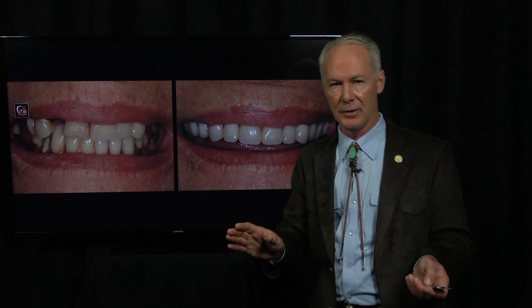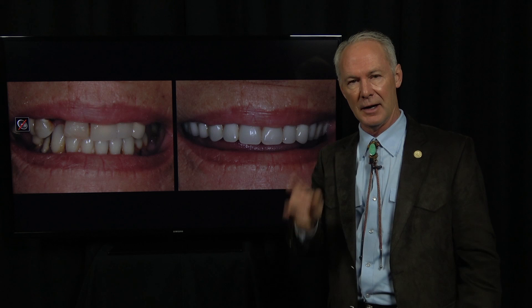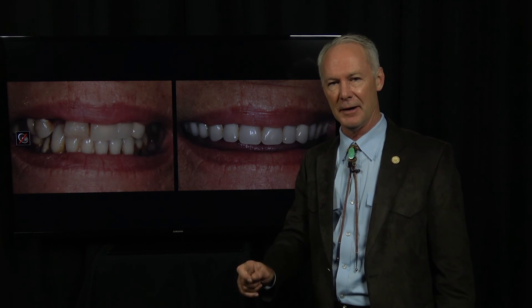These dentures are really stable and they work great as a temporary denture. That's the Dental Minute. These procedures work and they work every time.